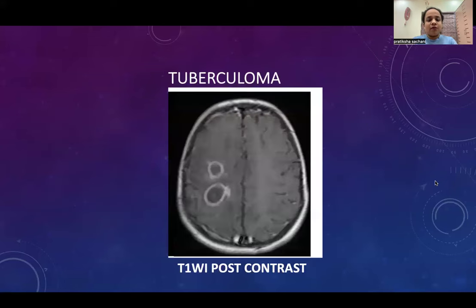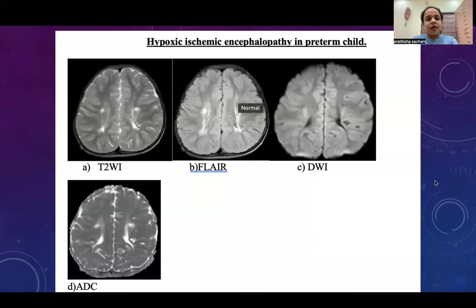This is a case of a pediatric patient with pulmonary TB who presented for MRI brain. This is the axial section post-contrast image showing ring-enhancing lesions in the right frontoparietal region, which was suggestive of tuberculoma. This is a case of HIE in a preterm child showing hyperintensities in T2 FLAIR periventricular region with no restriction on DWI.